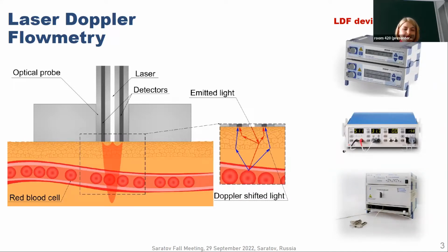In laser Doppler flowmetry, coherent light directed toward the tissues is scattered by moving objects and by static tissue structures as the photon migrates through tissue in a random pattern. When scattered on the moving objects, which are predominantly red blood cells, this light undergoes a frequency shift according to the Doppler principle, and light scattered from the static tissues remains unchanged in frequency.